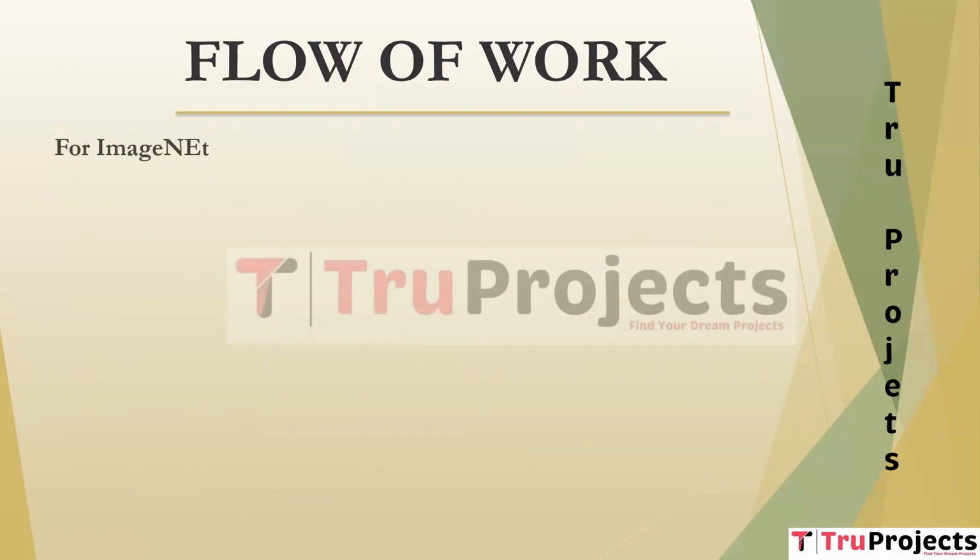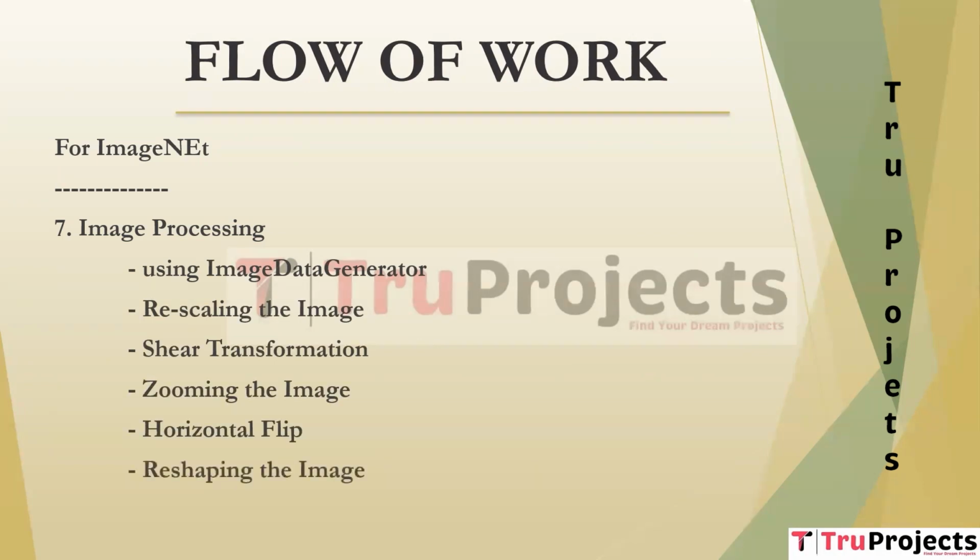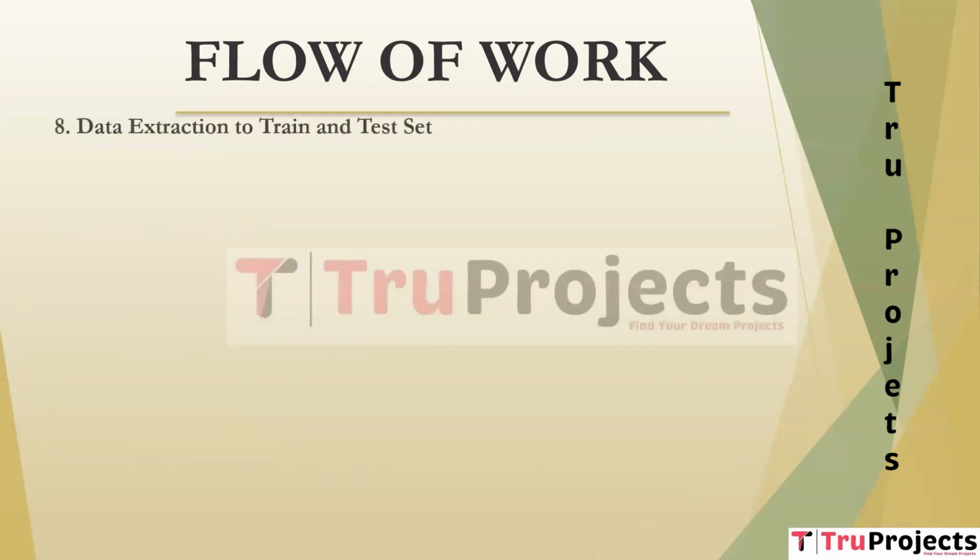From ImageNet. Image processing. This module focuses on preparing the ImageNet dataset for use, including tasks like image rescaling, shear transformation, zooming, horizontal flip, and reshaping. Data extraction to train and test split. It involves splitting the data into training and testing sets, a crucial step in machine learning.